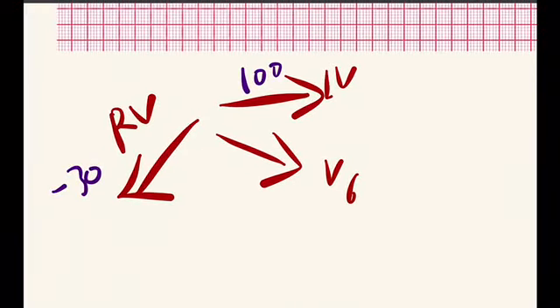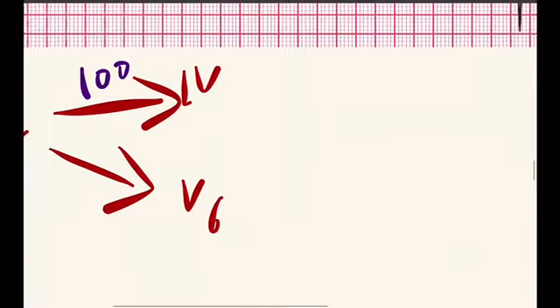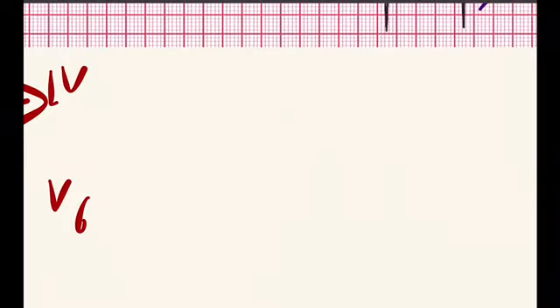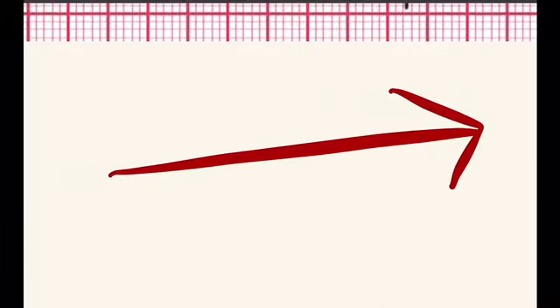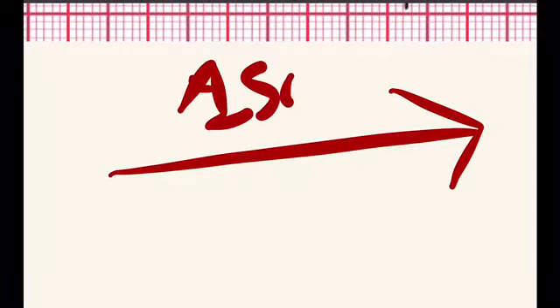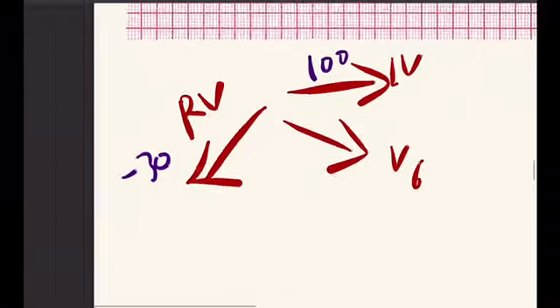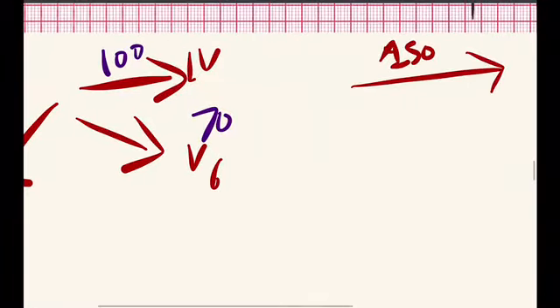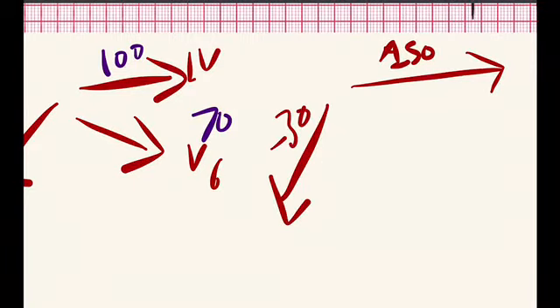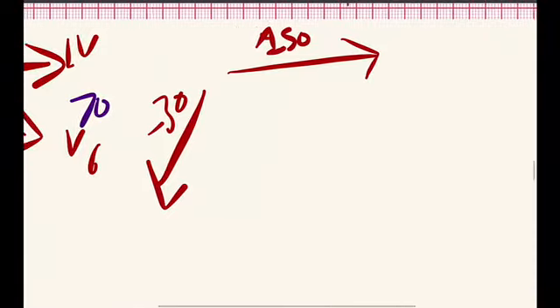And now there is hypertrophy of the left ventricle, so now the resultant vector will be having more magnitude. Suppose the magnitude of this left ventricular vector is now 150, and the resultant vector was 70. Now the right ventricle has the same minus 30 as the magnitude.